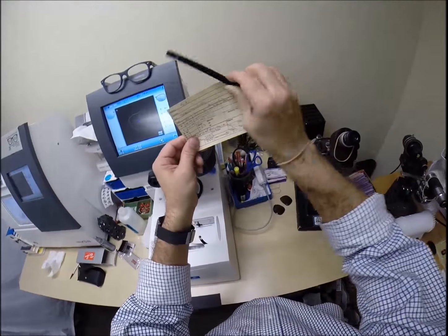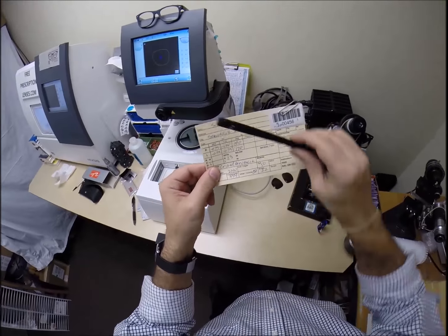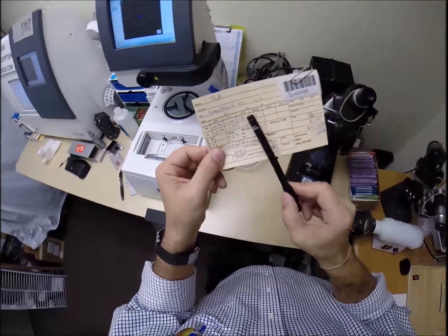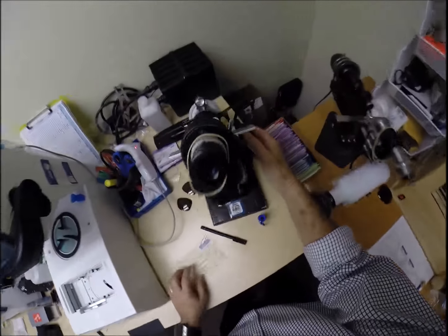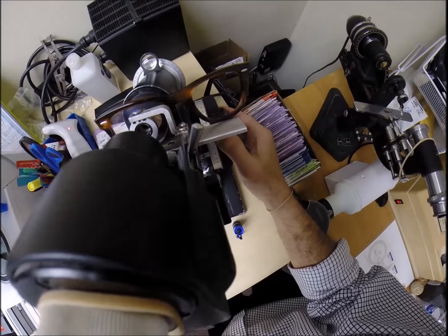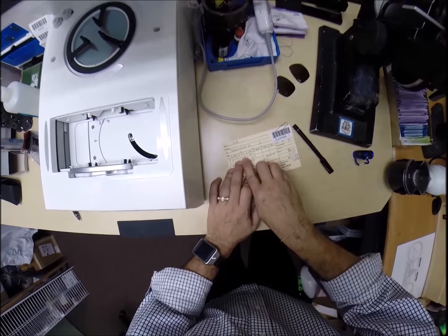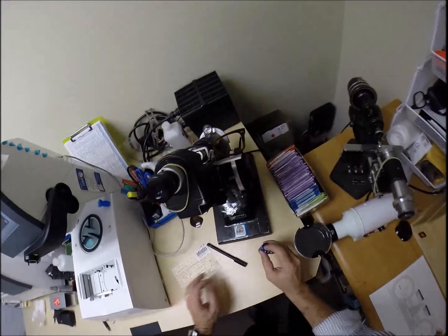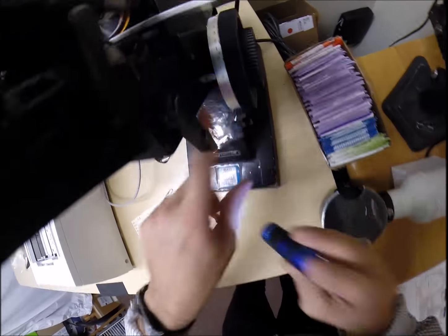A straight line is 0 to 90 to 180. We're going to keep that fine-tuned. Actually, 0 and 180 are the same number, so we're staying there. The first 2 numbers are real values. Well, let's actually check your astigmatism correction. So we're going from -75. We're going to subtract another -1, which is 4 steps. And we're at -175. Now we're 1 tick mark away from 2.